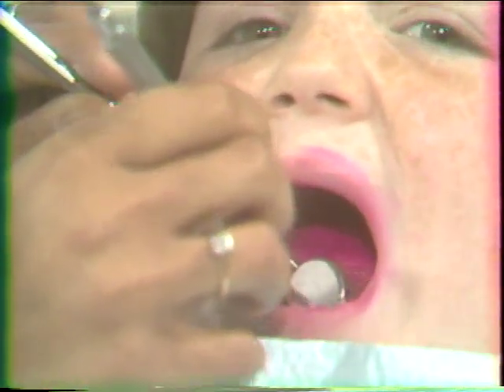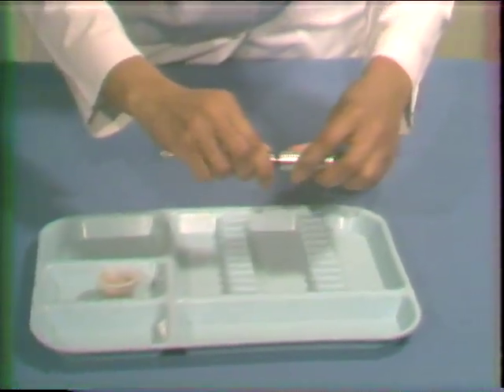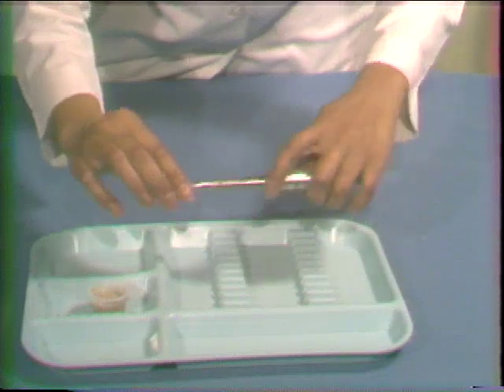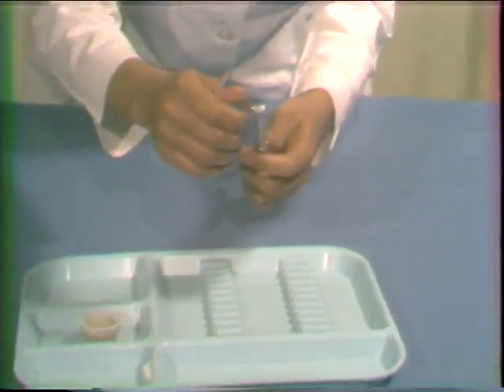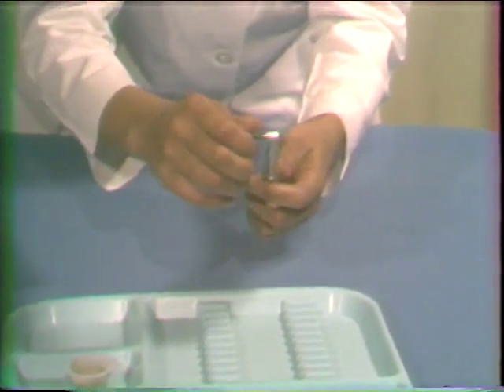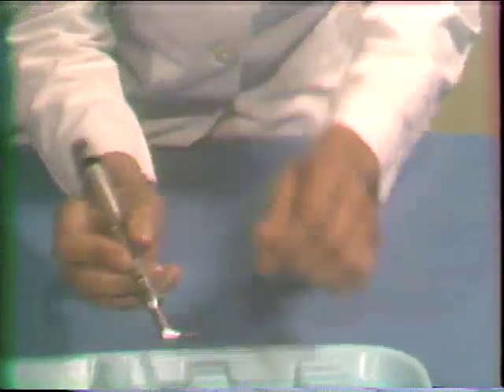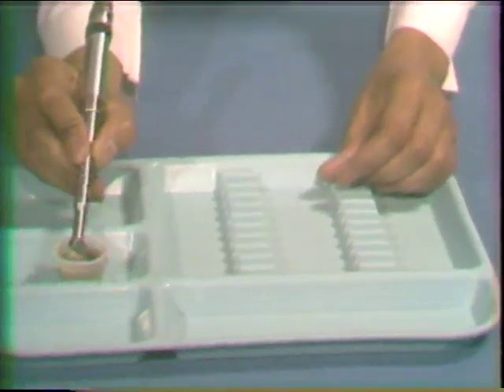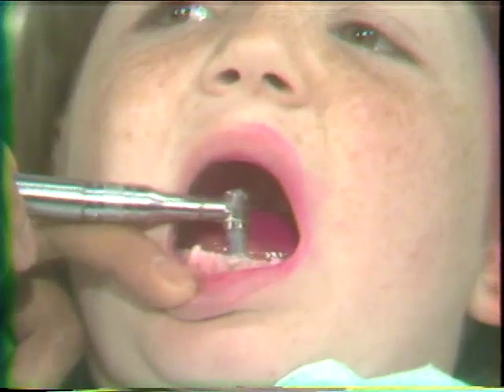When you are ready to begin the prophylaxis, the prophy angle is placed on the low-speed handpiece and the rubber prophy cup is attached. The cup is dipped into the prophylaxis paste. A saliva ejector should be used to remove excess saliva so the patient does not need to expectorate frequently.